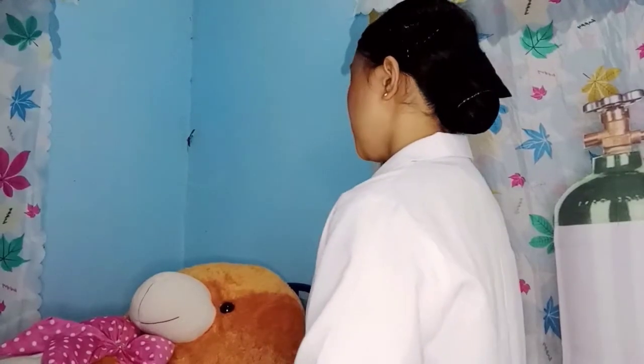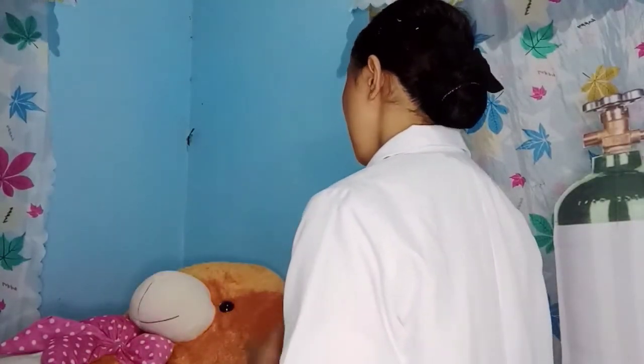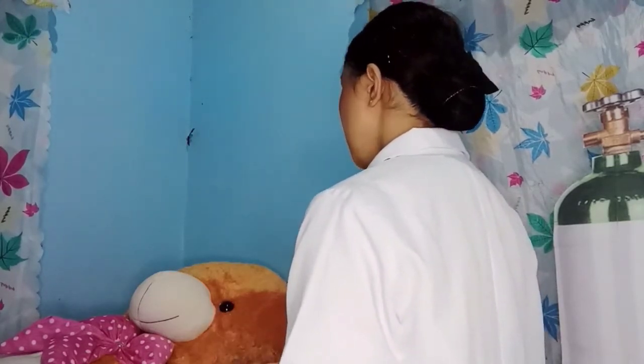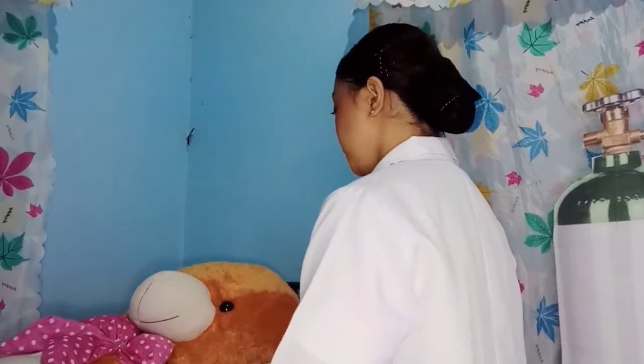And then next, explain what you are going to do and the reason for doing it to the patient. So good day ma'am, today I'm going to administer oxygen by mask. It is important because it can maintain adequate tissue oxygenation while minimizing cardiopulmonary work, and also to deliver oxygen to people who don't otherwise get enough of it. And lastly, provide relief to people with respiratory disorder. Is that okay with you ma'am? Okay po. Review safety precautions necessary when oxygen is in use.